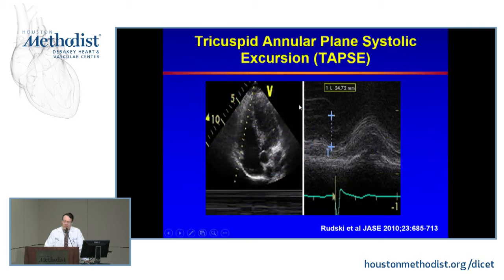TAPSE is very famous, and we do it routinely, and we want to report it routinely in cases with RV dysfunction or suspicious RV dysfunction, pulmonary embolism, patients with cardiomyopathy, advanced heart failures, LVADs, etc.